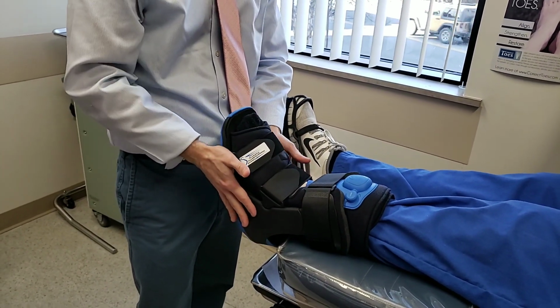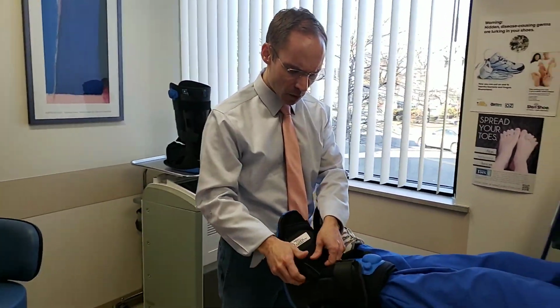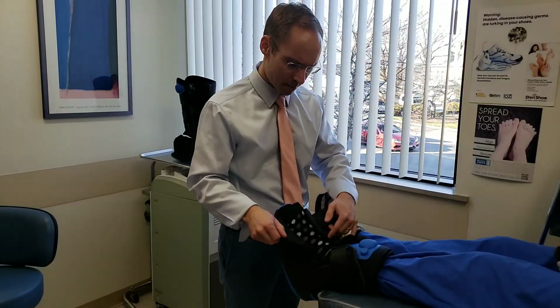There's a lot of different types. Some of the other uses for this would include if you have an ulcer or a wound on the bottom of the foot, or an area that's painful. Now, one thing if you're treating an ulcer or a wound, what I recommend is you add a little insert inside to the bottom.